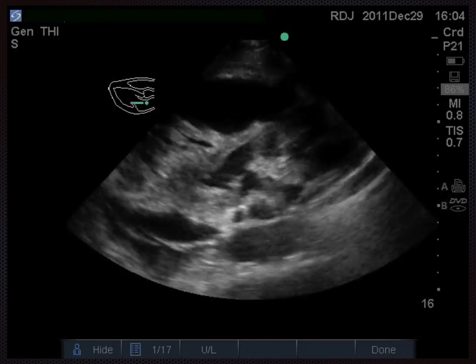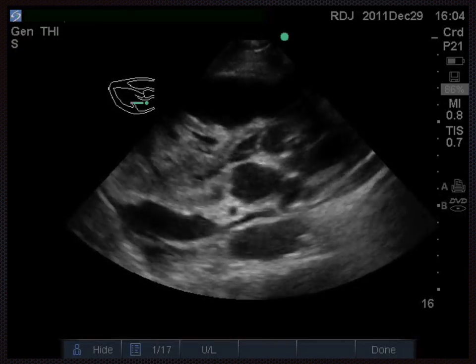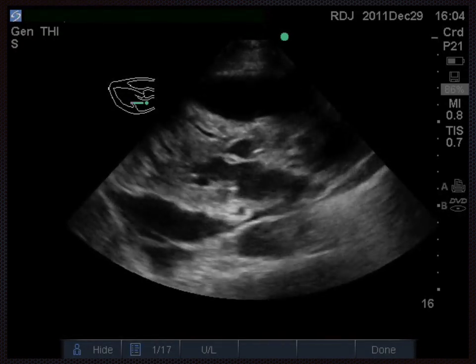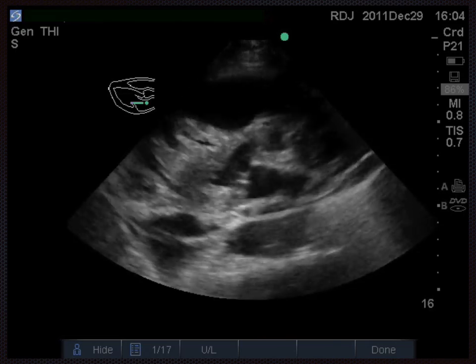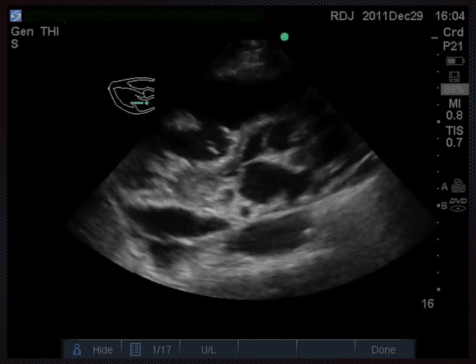Now looking at the left ventricle, this looks really strange, because the internal diameter is actually quite small and narrow, and certainly less than the 6 centimetres we would say would be the maximum we would expect in diastole. Looking at the left ventricle wall as well, we know this should be about a centimetre.